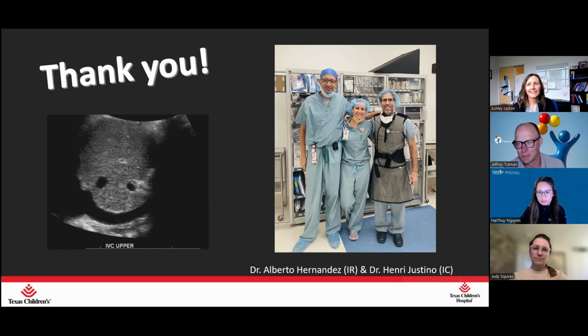That is a great question, because these are such time-consuming exams, trying to get specific locations and getting all these velocities and angle correction and all the things. If there's a straightforward question, is there a portal vein thrombosis? I just feel like we could probably get away with not doing a complete spectral Doppler. I think grayscale and color is good. When we get in there, maybe we start seeing some funny business going on, that's probably when it's warranted to do a full Doppler.